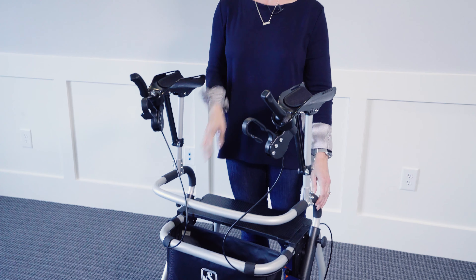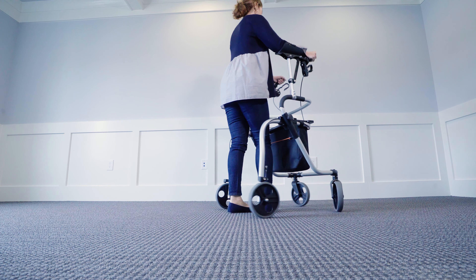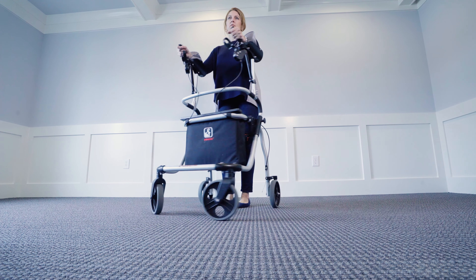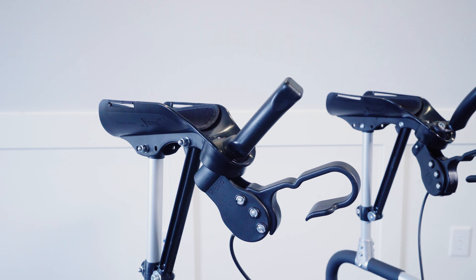First of all, it's made out of tubular aluminum which makes it very lightweight. As you may know, platform walkers usually are not very lightweight. These are the platforms that the elbows rest in and you then hold with your hands. Now Sophia didn't need that function because she has very strong hands and wrists. Typically platform walkers are used for those who have arthritis, hemiparetic, or a diplegic spastic person who may have weak upper extremities — and it's very stable.